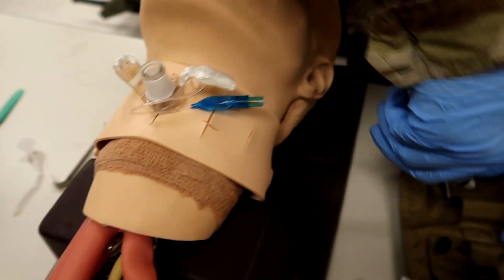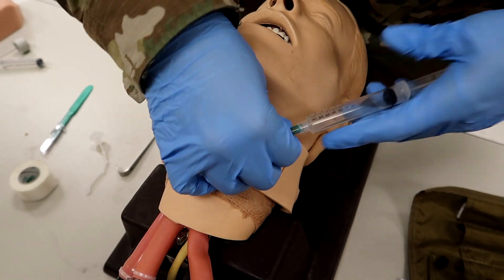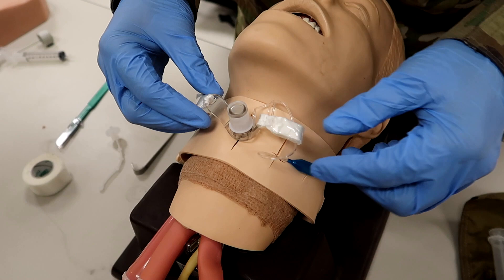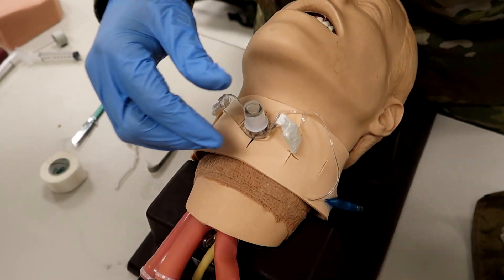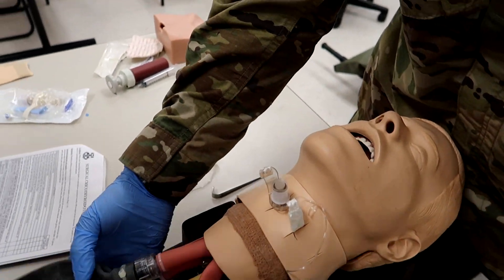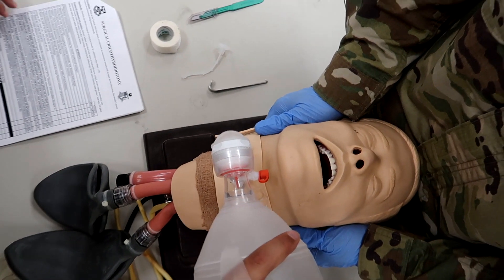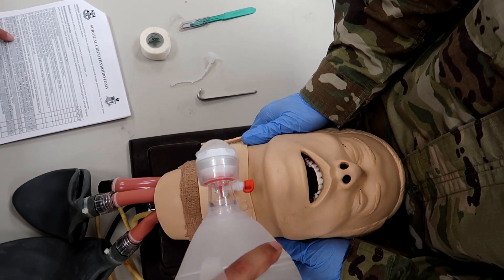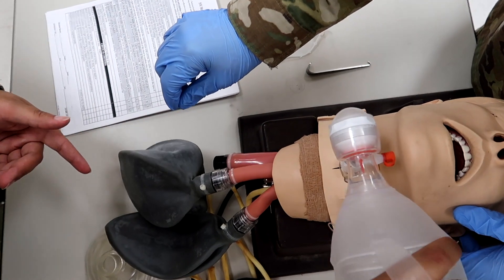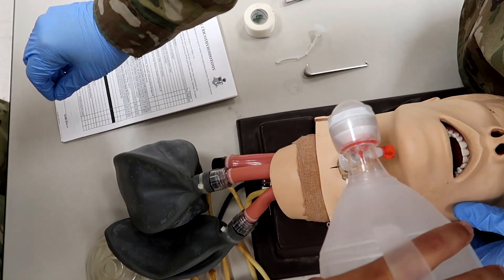Now that he's got that in there, he's going to inflate the cuff with 10 milliliters of air. It is inflated. Now he's going to direct his CLS to ventilate the casualty twice with the BVM. I'm going to go ahead and do that for him — ventilating twice while he auscultates to confirm proper tube placement. As you can see, we've got it, it's filling up with air. He's confirmed proper placement.